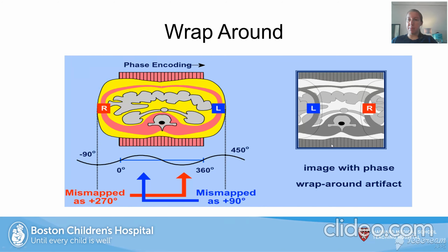So basically what wraparound aliasing looks like is you've got some fold over here. You can see this is the left side that's been folded over here, and then the right side has been folded over here. It has everything to do with the sampling, and the bandwidth will dictate that.